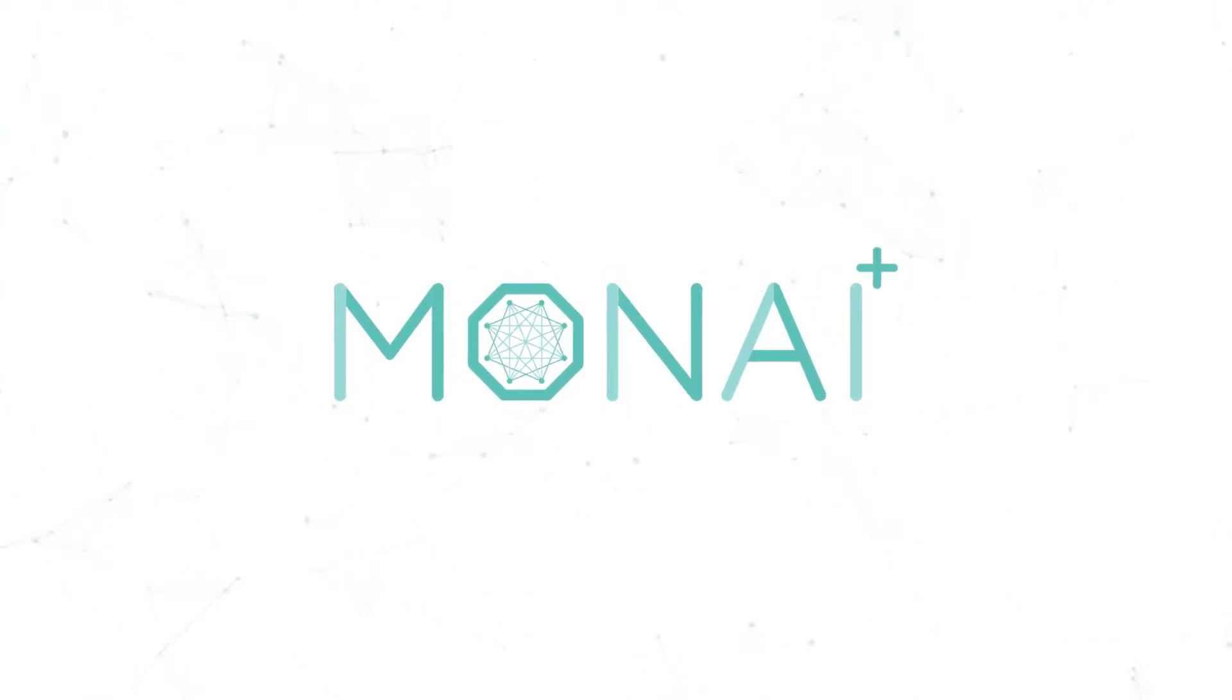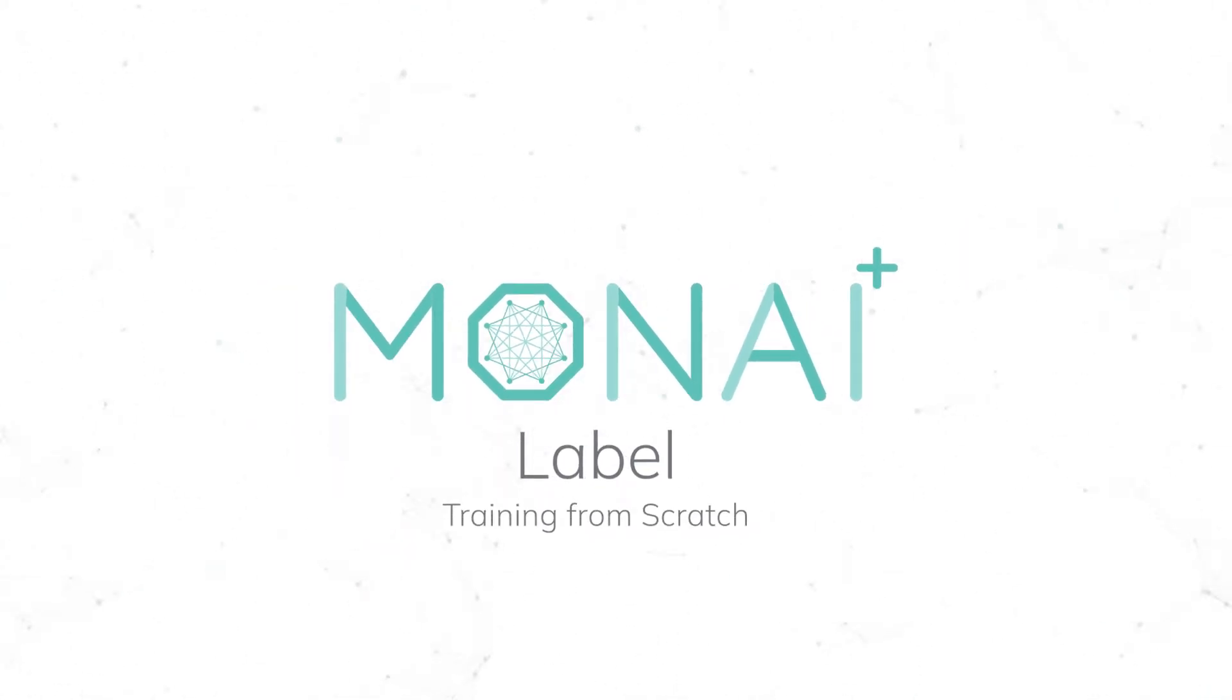Hi everybody, in this video we're going to be selecting a custom data set and training a model from scratch using Monoilabel. Let's get started.